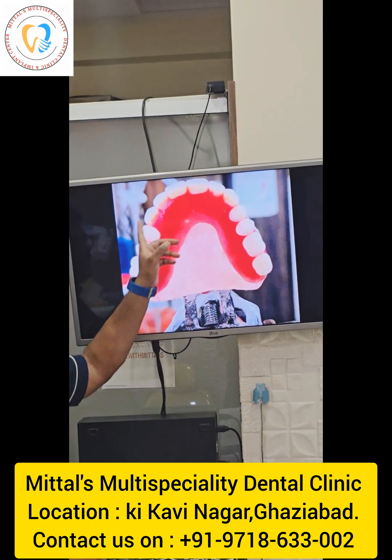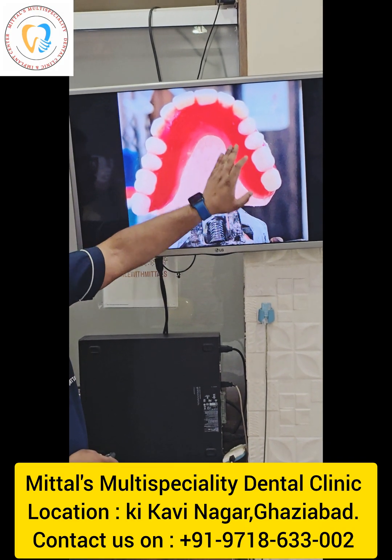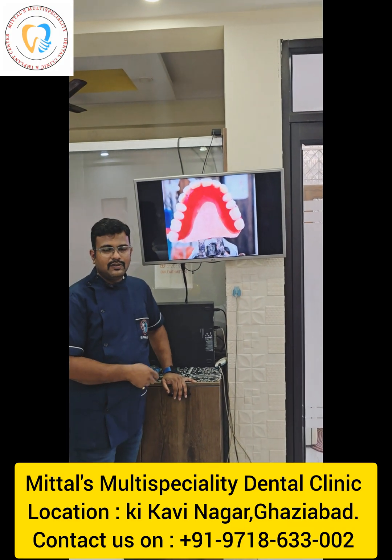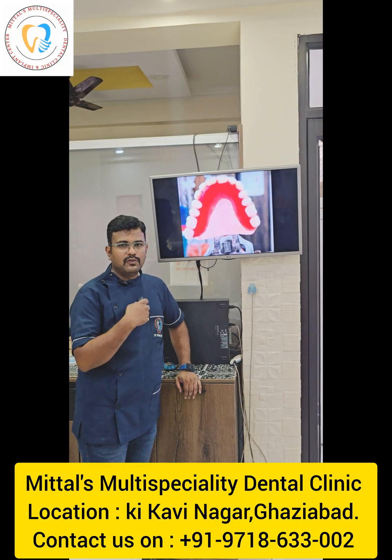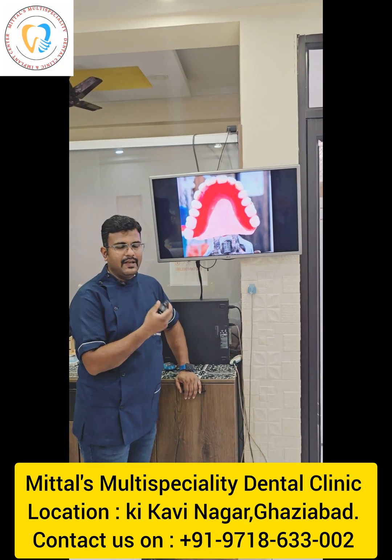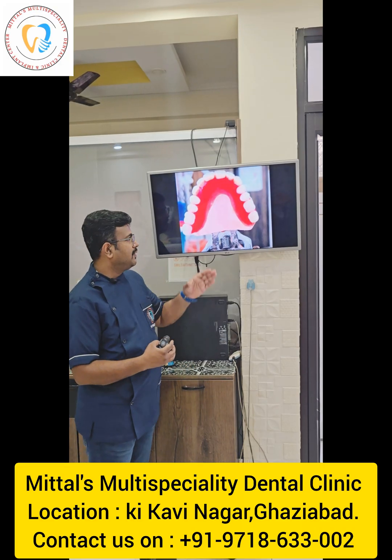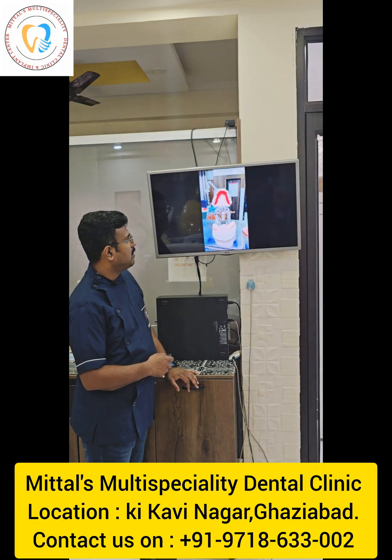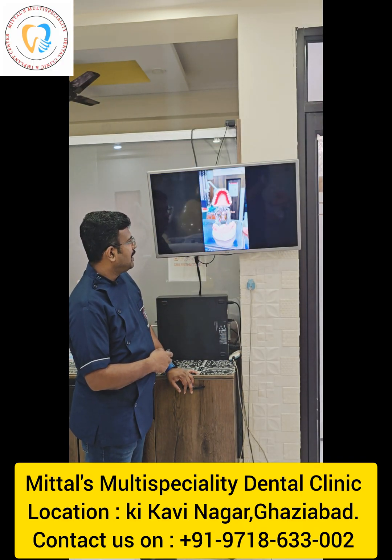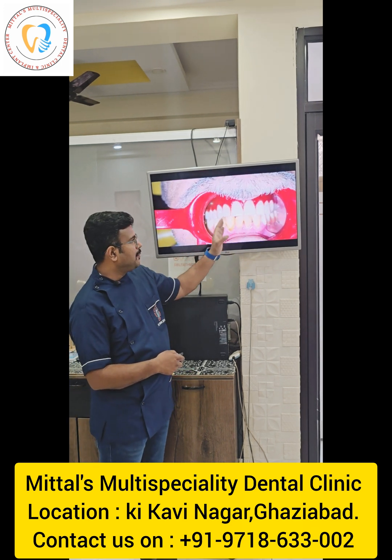Now look at the wax up and trial. Can you appreciate where that zygomatic implant is? So this is the beauty of the lab. This is what we have to give to the lab: the finely trimmed abutments so that we can have such a beautiful appearance. Look at the jaw relation and the teeth setting on the articulator and in the mouth as well. This is in the mouth. The patient was quite happy to see it.